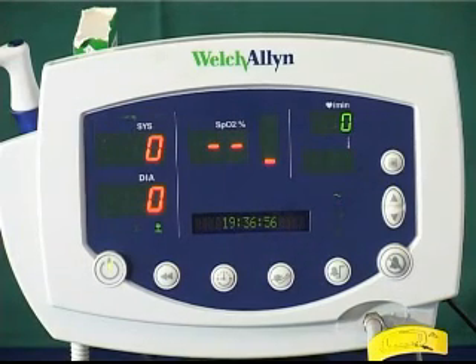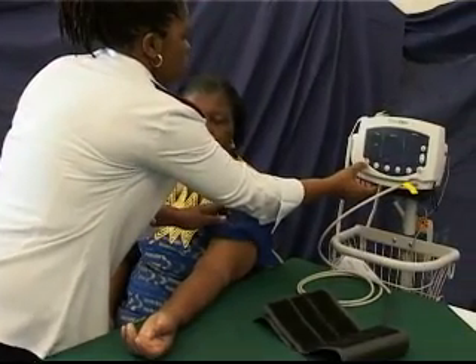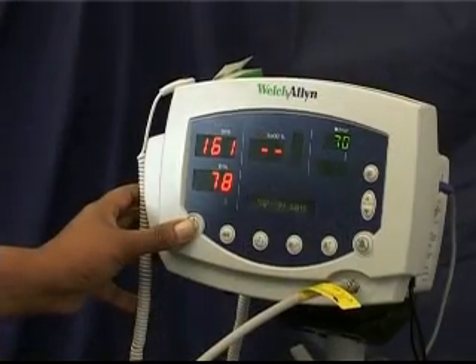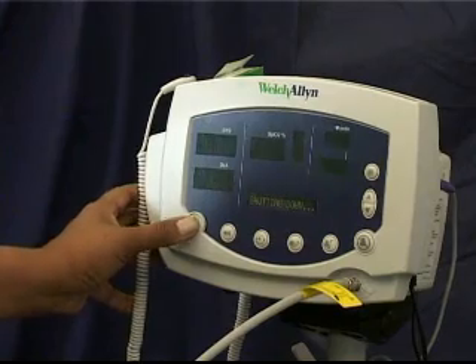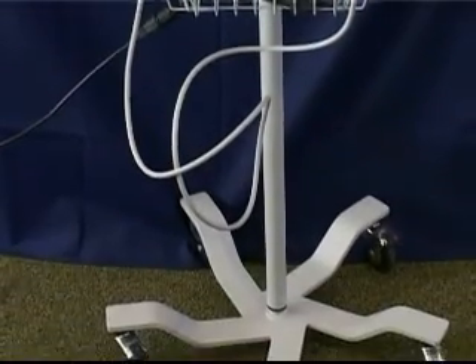Electronic blood pressure units facilitate the automatic reading of a patient's blood pressure. They are becoming more and more popular as a result of their user friendliness and affordability. Electronic blood pressure meters are available as stand-alone or wall-mounted units and can also be placed on a mobile stand.